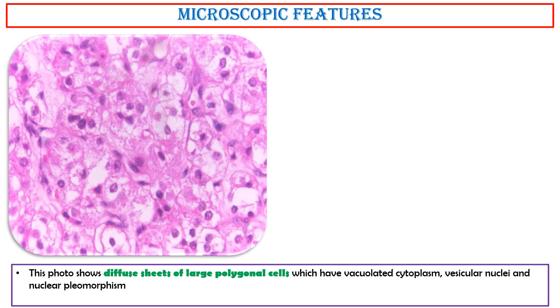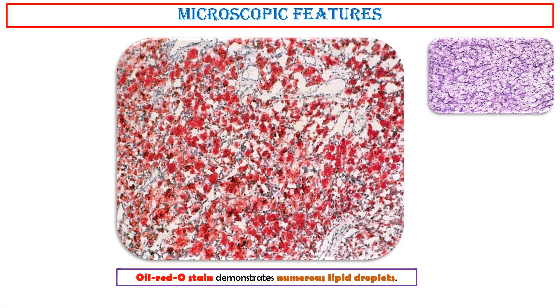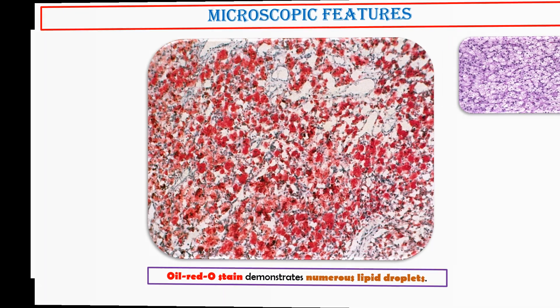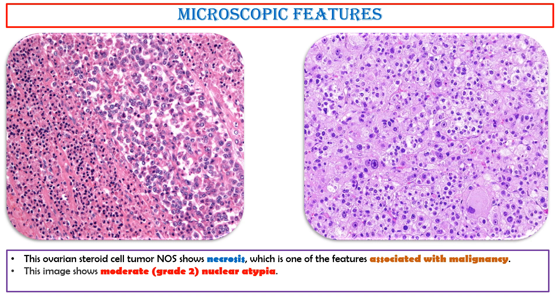This photo shows diffuse sheets of large polygonal cells with vacuolated cytoplasm, vesicular nuclei, and nuclear pleomorphism. Yellow-brown lipochrome pigment granules are frequently seen in the cytoplasm of steroid cell tumors. Oil red O stain demonstrates numerous lipid droplets in this photo. This ovarian steroid cell tumor, not otherwise specified, shows necrosis, which is one of the features associated with malignancy. This image shows moderate grade 2 nuclear atypia.